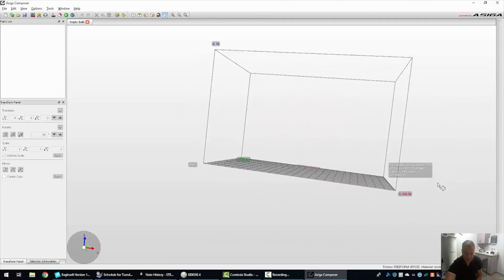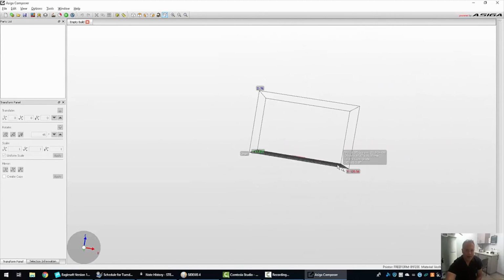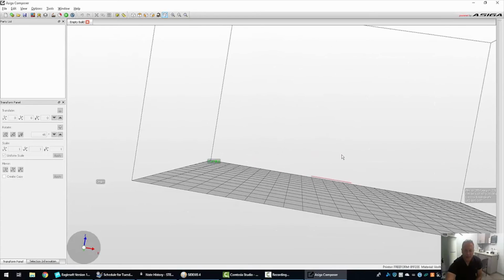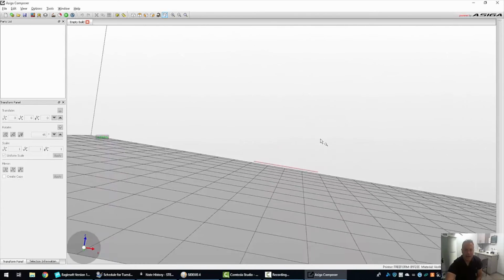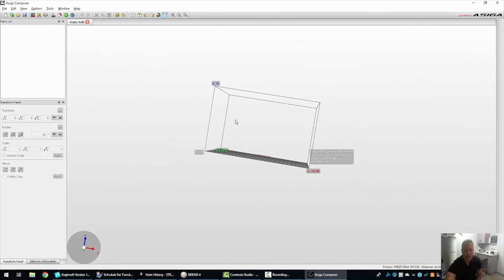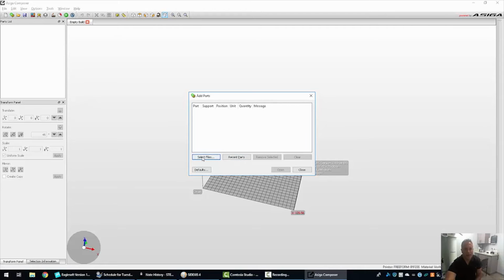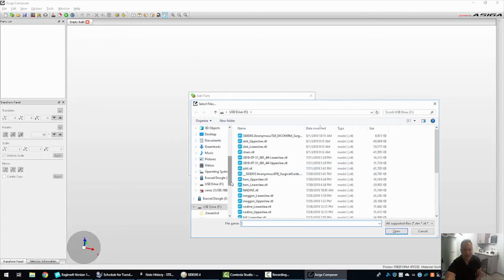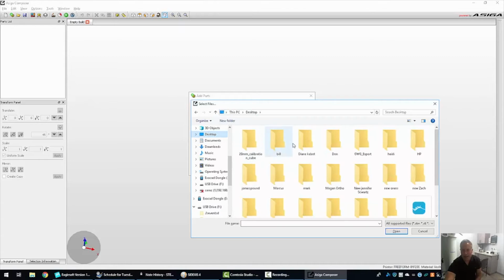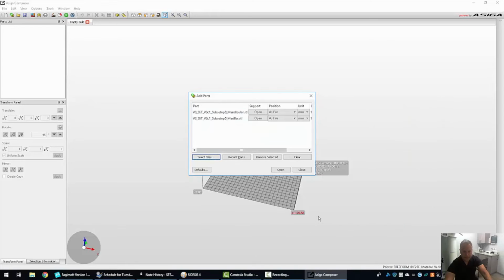So the right mouse button rotates, the left mouse button pans, the middle mouse button zooms. So we've got a little different sort of configuration than what most people are used to. We're going to go ahead and add some aligner models. This is not such a big deal. We'll go on the desktop and we'll find someone. And let's go ahead and select 2 aligner models and hit Open.